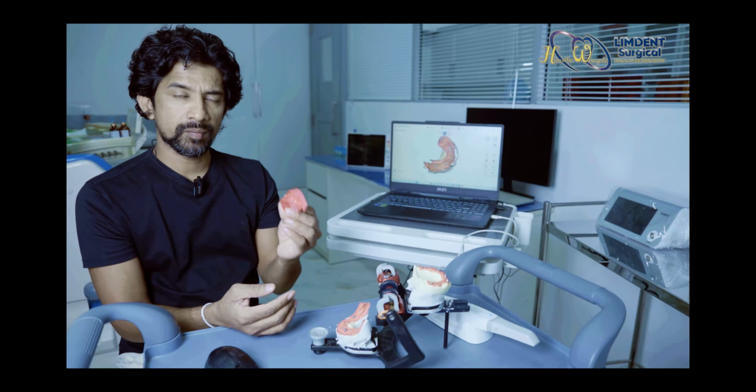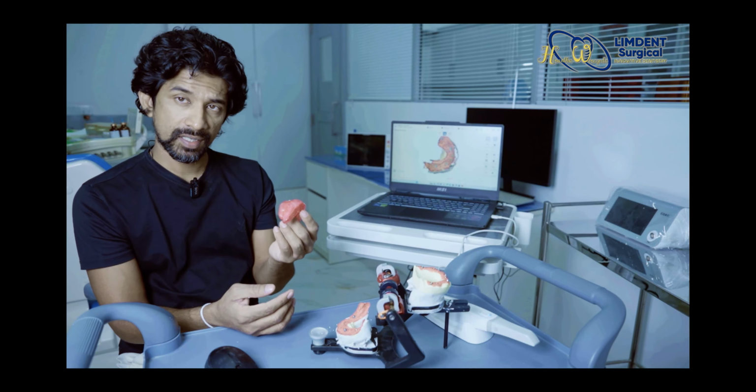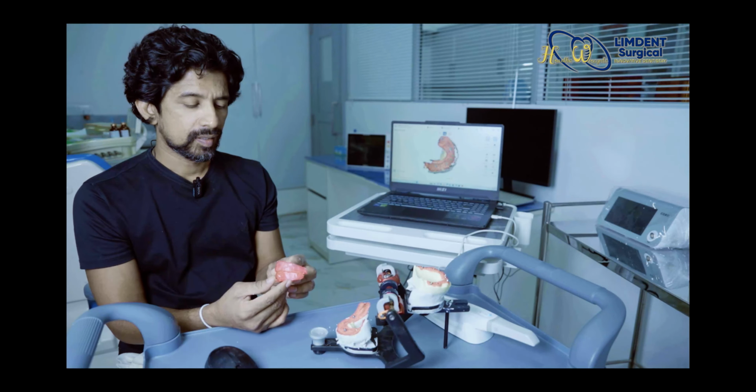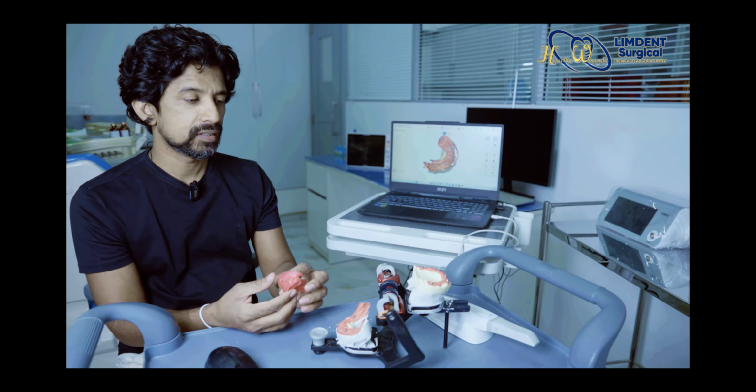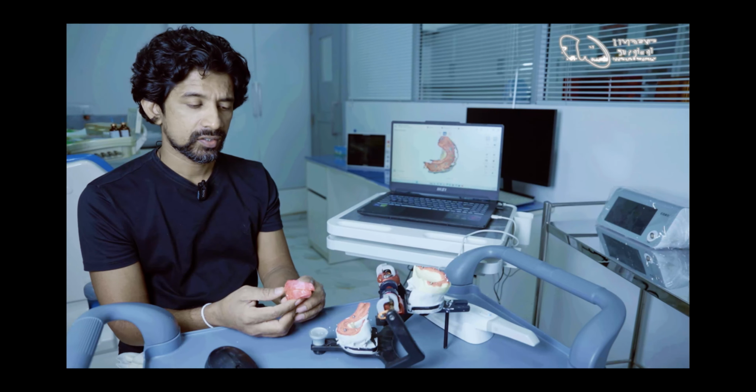So this bite block can be separately scanned. Once you do the separate scanning, in some of the software, when you're doing the digital dentistry of making the prostheses, the bite block can be orientated on the impression, the cast, or this working cast that you have scanned and transferred into the software.